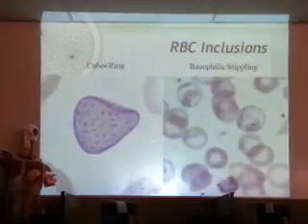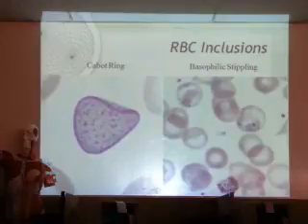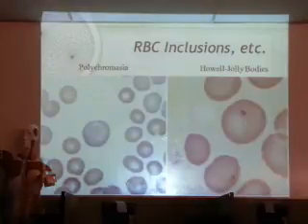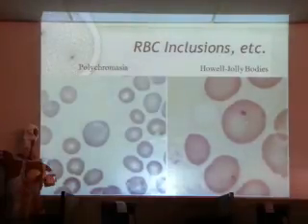Okay, more. Yeah. When you say Rh antigen, stomatocyte, is that with Rh antigen or without Rh antigen? Oh, that example is a very rare example. 1 in a million patients or something like that have no Rh antigen, and these patients can show stomatocytes. But it's not the only condition. So morphology is great. It gives you clues, but it's not that diagnostic.